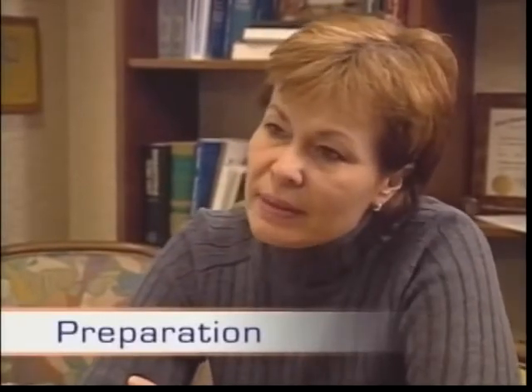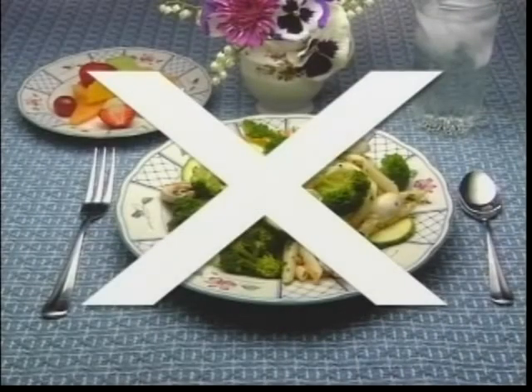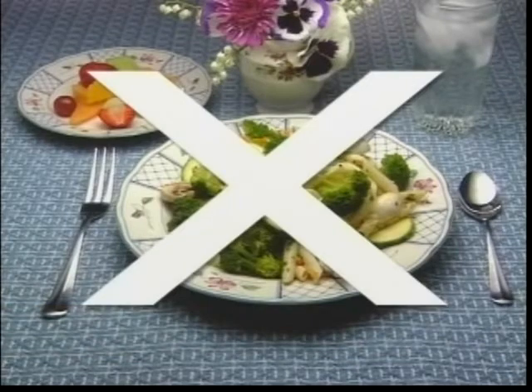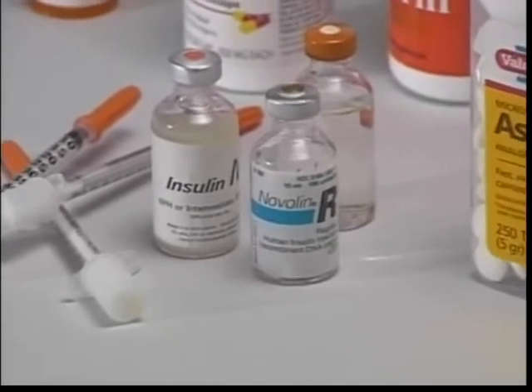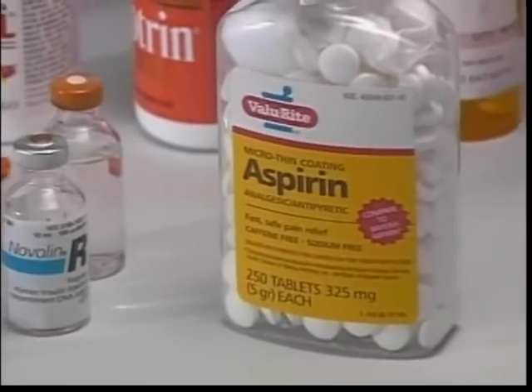Properly preparing for this procedure is very important. There are many effective preparation methods. Your doctor will decide what methods are best for you. Ask him any questions you may have and follow his instructions. You may be told not to eat or drink anything 8 to 10 hours before the procedure because the endoscope cannot see through digesting food. This will also reduce the risk of some complications. Tell your doctor what medications you are taking. He may ask you to stop taking them or change them a few days before your endoscopy.